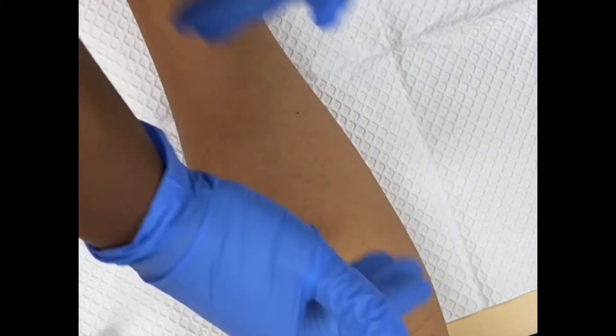Today we are going to be doing a TB test, also known as a PPD. When you are doing a PPD, you are working with the anterior forearm.